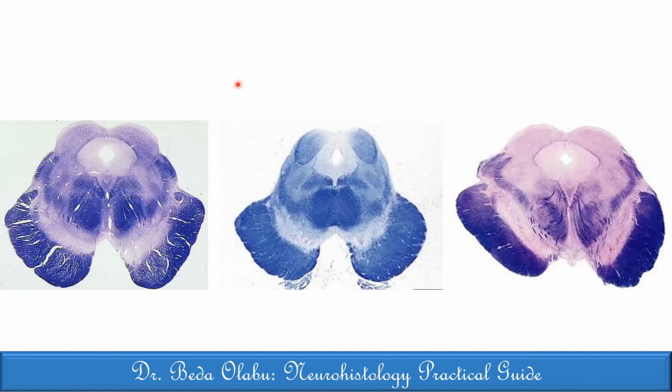It's a brainstem histology because of the characteristic box shape appearance generally. And then we can see, from dorsal coming back, the cerebral aqueduct with the periaqueductal gray matter.